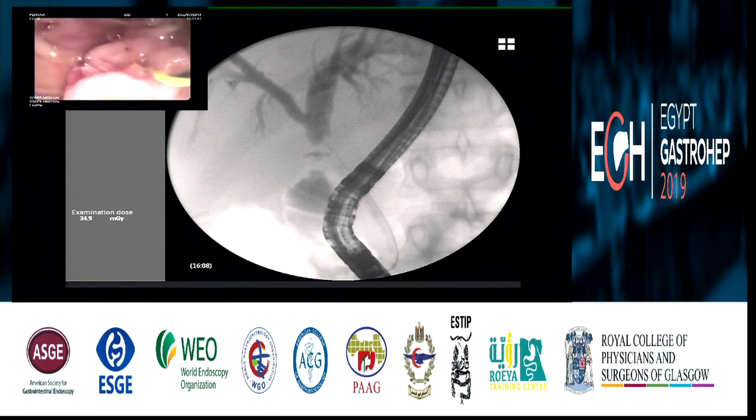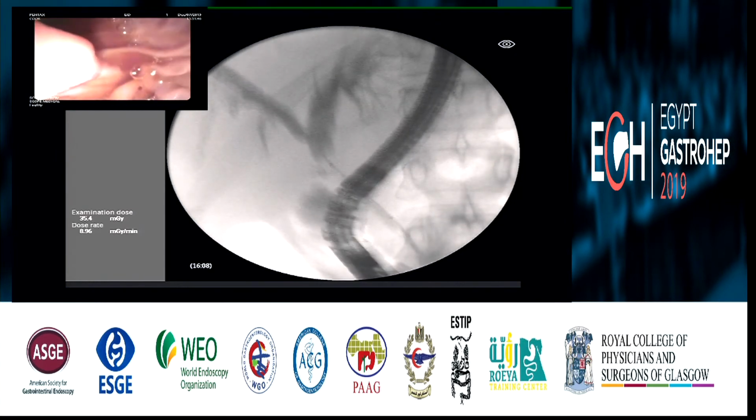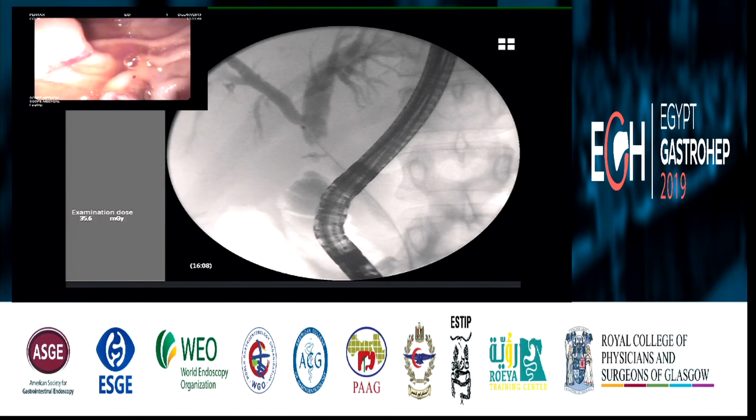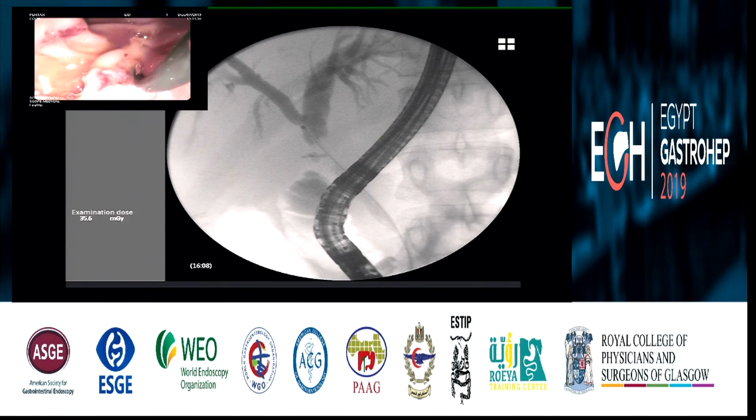Ivo, we have a question from the floor for you. Please, when can we use the Soehendra dilator compared with the balloon, which is expensive for us? Usually we use Soehendra because the balloon is expensive. Yes, also Soehendra is a good option.